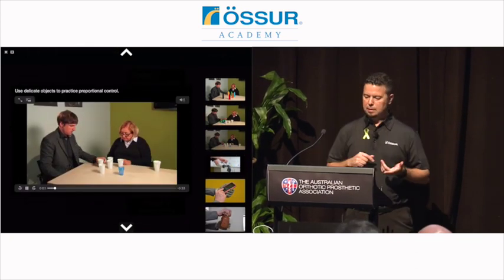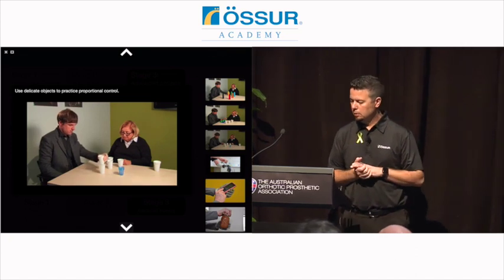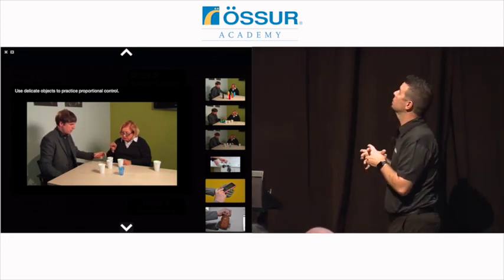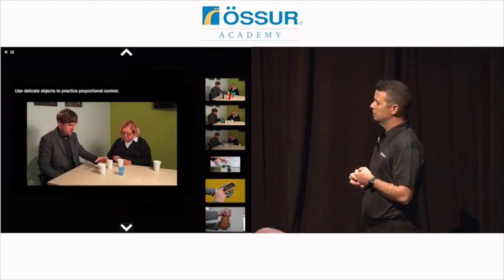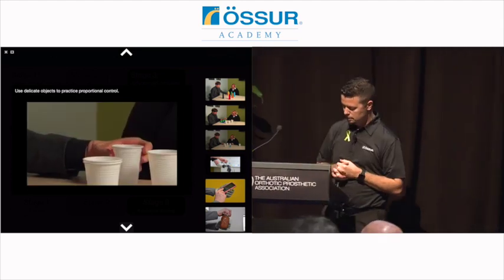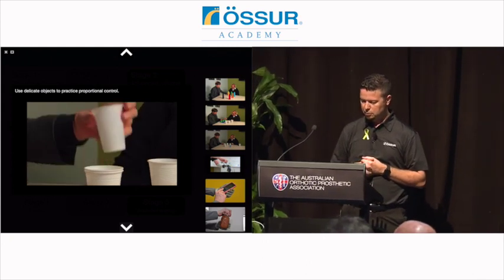And then the cups. This is the example that I was telling you earlier. They're going to do a close-up here, and you'll actually see the hand squish a little bit more than it should. And that's just feedback for him to know that he needs to back off on that force. There, squished it a little bit, opened up.